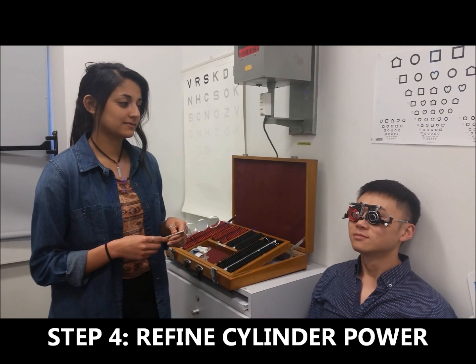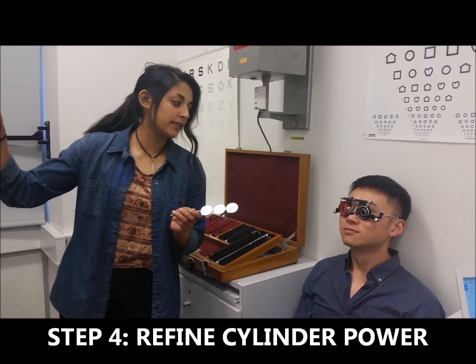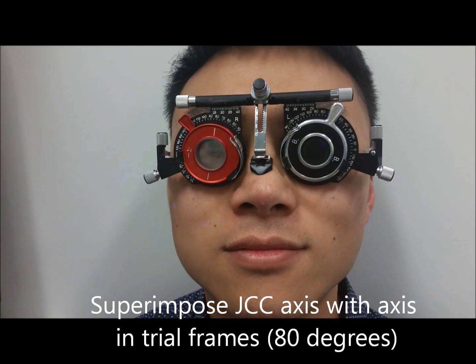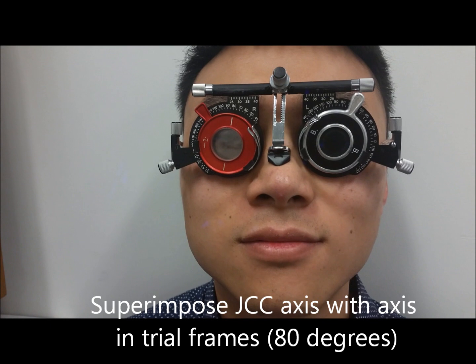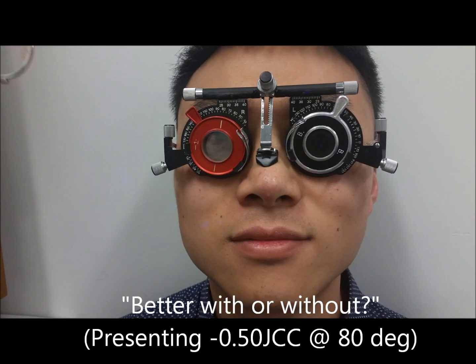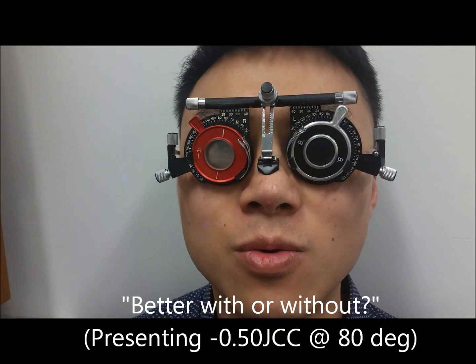Step 4. Refining cylinder power. Okay, Hongbin, I'm just going to get you to look up at the chart there for me and look at the O on the lowest line you can read. While superimposing the axis of the Jackson cross cyl with the correcting cylinder axis in the trial frame, the examiner then asks, so I just want you to tell me the same thing as before. Is it better with or without? Better with.